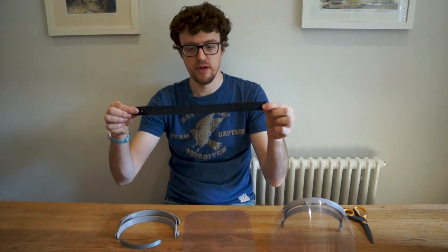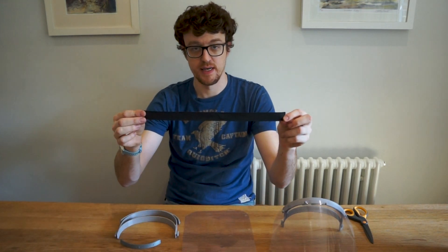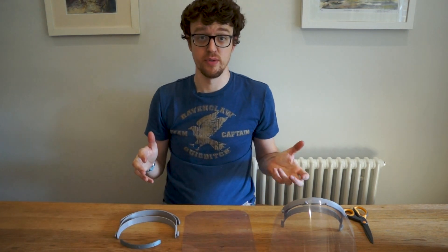And then you can see here two pieces of elastic: one piece of elastic which has buttonholes pre-cut into it, and one piece of elastic which has no holes at all. I'll show you with both of those the best way to assemble this.